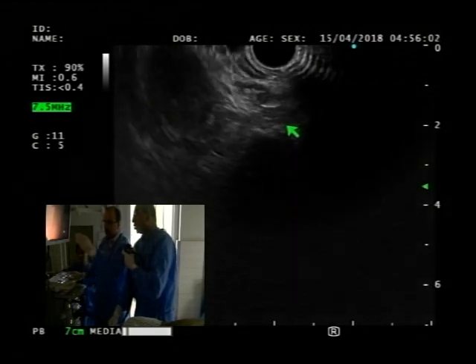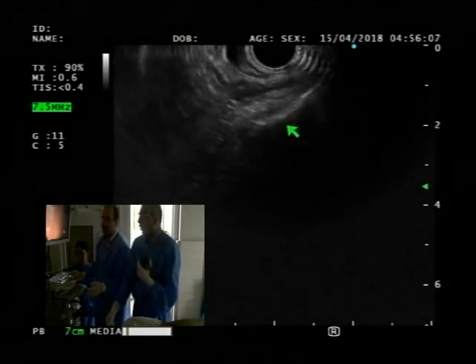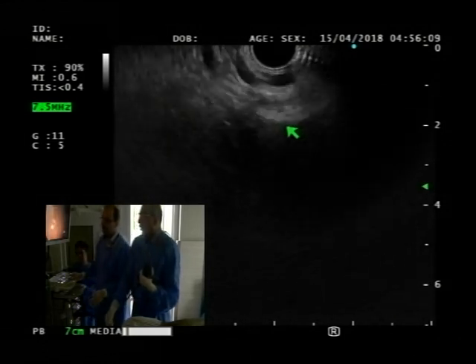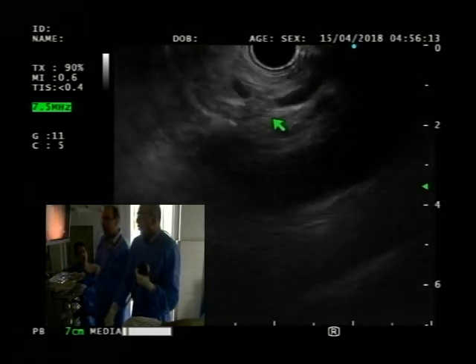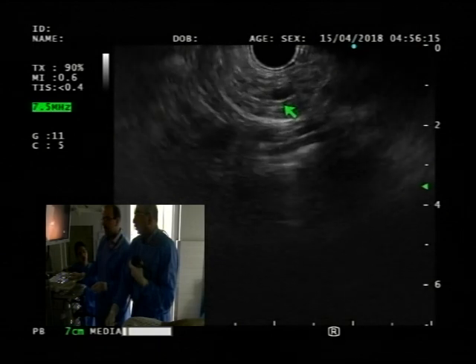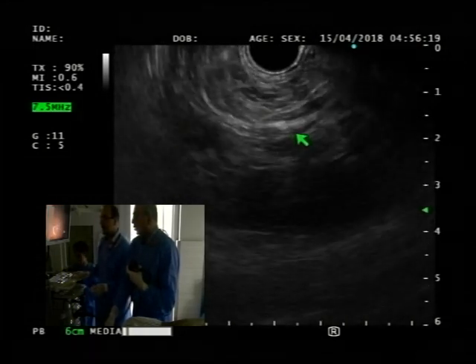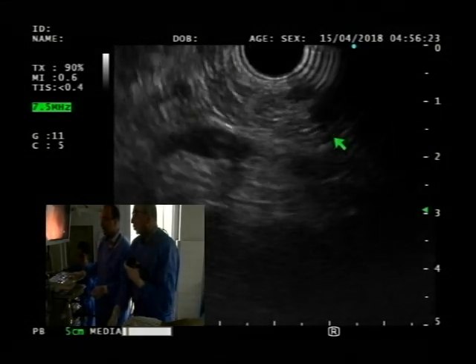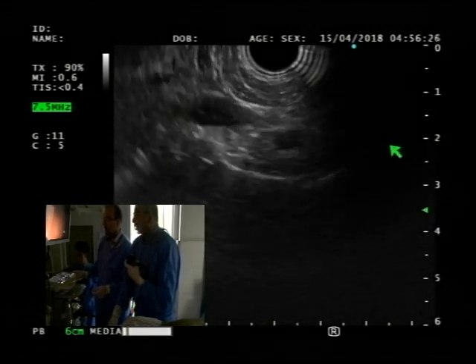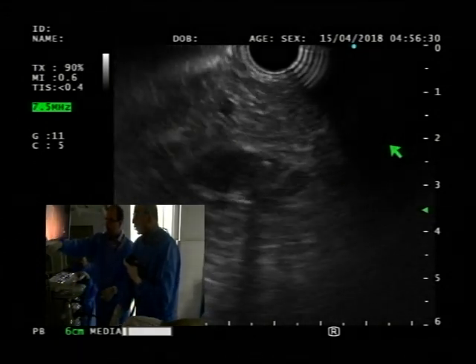Now you can go the other way to follow the pancreas towards the neck and head. So now go counter again. There, and now you may need to again advance the scope to see if... there you go. There's your pancreatic duct, and now if you advance, I'm going to just enlarge the image for you a bit. There you go. Or maybe that's too much. Okay. Now, pull back a bit because we may have lost the pancreatic duct there.